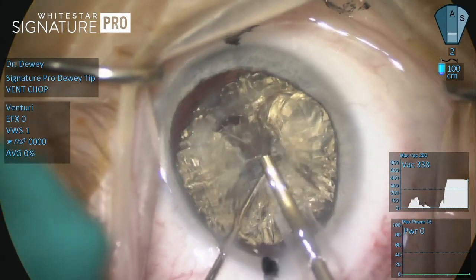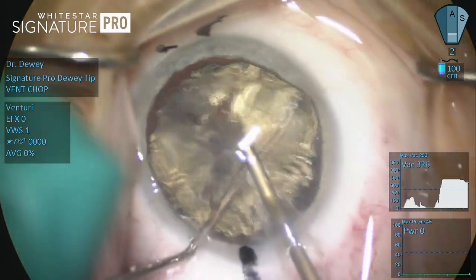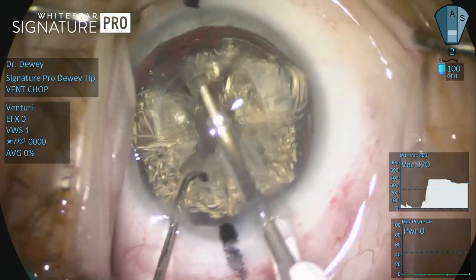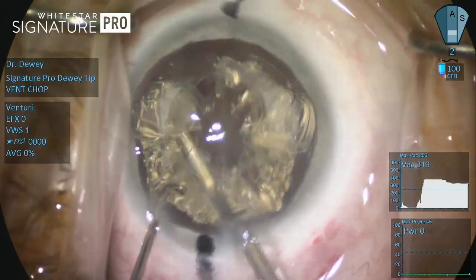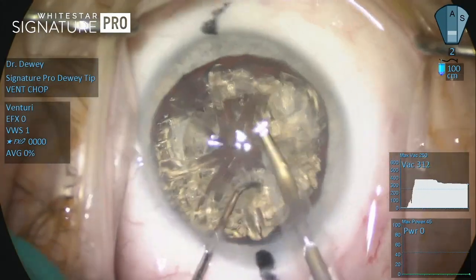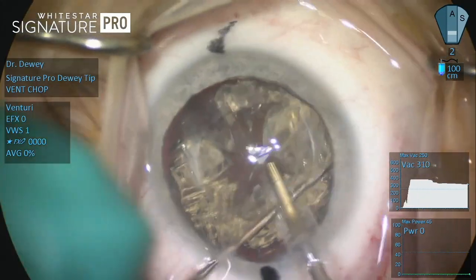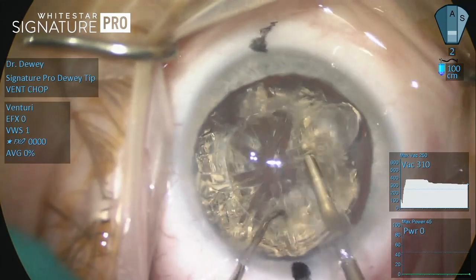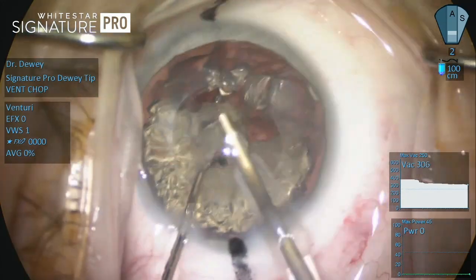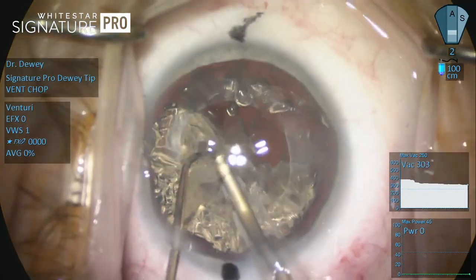Once the occlusion breaks, the distinction between the two vacuum systems becomes apparent. In peristaltic vacuum, the pump is controlled by sensors that detect the loss of occlusion and restores flow to the preset level.